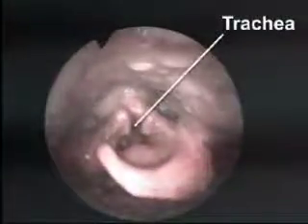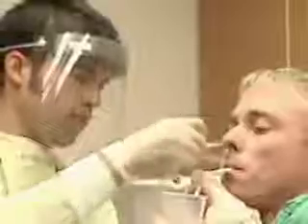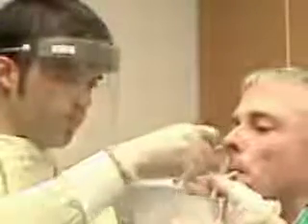As the tube reaches the level of the larynx, advancement is temporarily halted. The tube is then inserted as the patient swallows, and, once past the larynx, is rapidly advanced. Note that in this endoscopic view of the larynx, the trachea is frequently open and may be accidentally intubated with an NG tube. Note also that as the patient swallows, the laryngeal apparatus arises and the epiglottis covers the glottis, preventing tracheal entry. Once past the larynx, the tube may be inserted rapidly to the predetermined depth. Check the black markings on the tube to confirm proper depth of insertion.